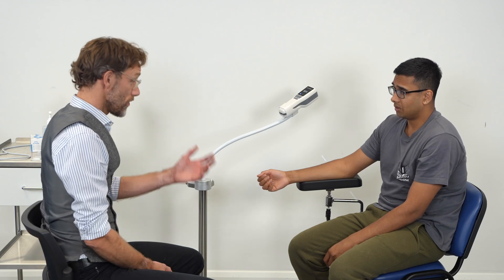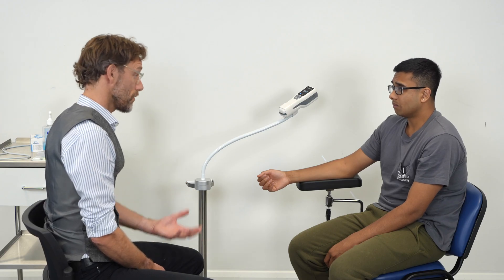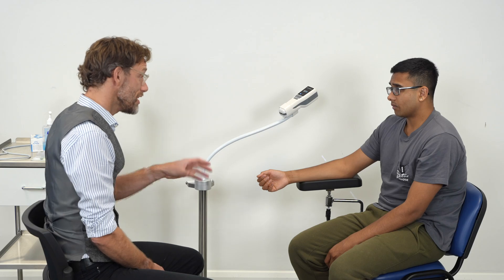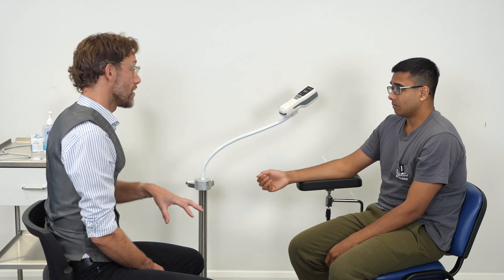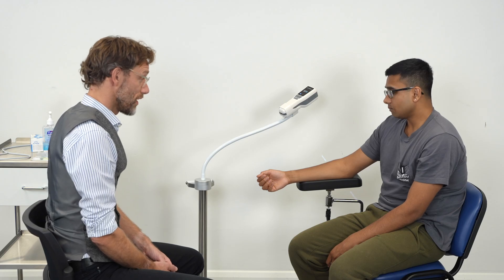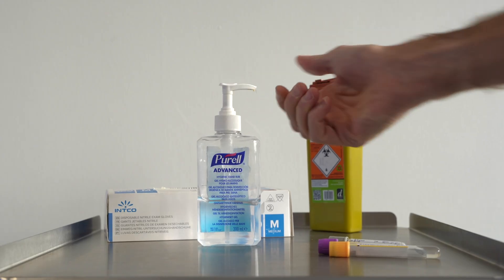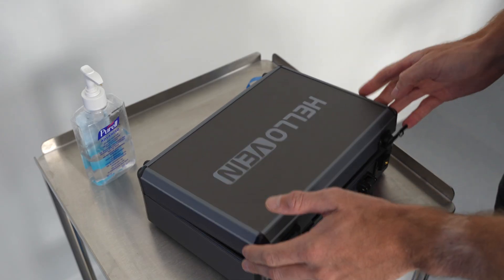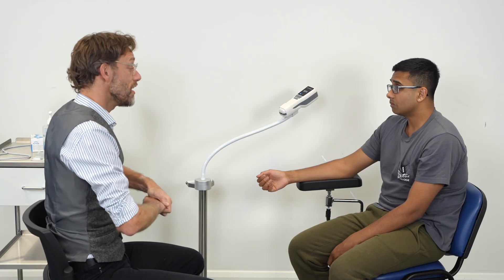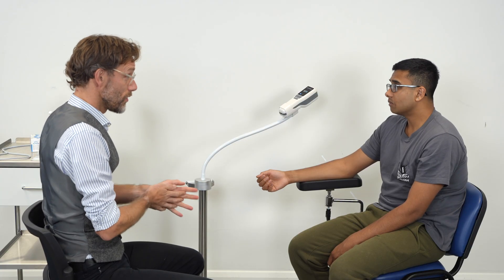Absolutely. We're more than capable of taking a blood sample without using this. But sometimes for patients such as yourself, being able to see the blood vessel and see what we're targeting can help things, particularly if people have had trouble finding the veins in the past. So this is one of the vein finders. Let me just show you. I'll bring the vein finder over, and you should be able to see the veins in your arm that we'll hopefully be targeting. That will hopefully give you an element of reassurance.